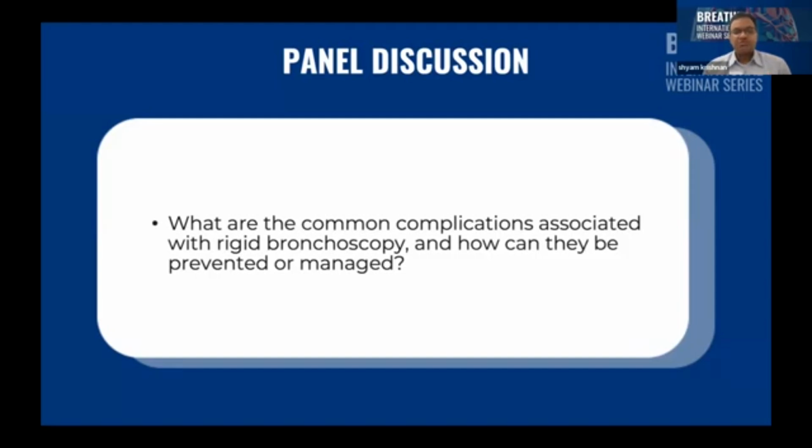Then it depends on the techniques related to the therapeutic interventions you do. For example, like Vishwesh had mentioned, the melanoma case where there was a huge mass in the trachea. In those cases, you need to make sure that the patient is breathing fine, despite the mass. The patient was alive, he was breathing himself. So that is the patient's tone that kept the patient alive. He was breathing because of that.